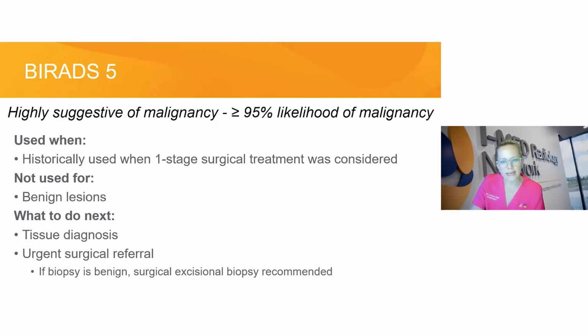I would be inclined to say, as a GP, if I had a patient who had a BI-RADS 5 lesion, they are going to have that lesion excised regardless. As soon as a radiologist is making this sort of call, they need a surgeon. So it doesn't matter what the biopsy says. If you have a patient who has a BI-RADS 5 lesion, their biopsy is booked for 3 days, 5 days, 7 days, it probably doesn't matter.